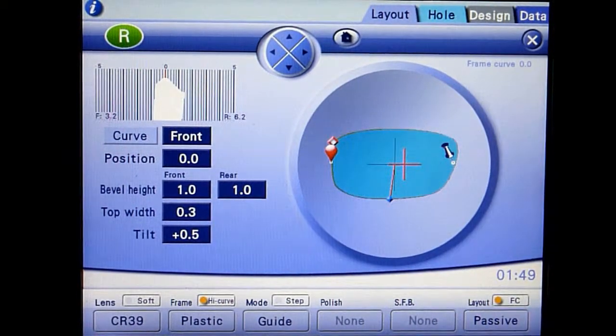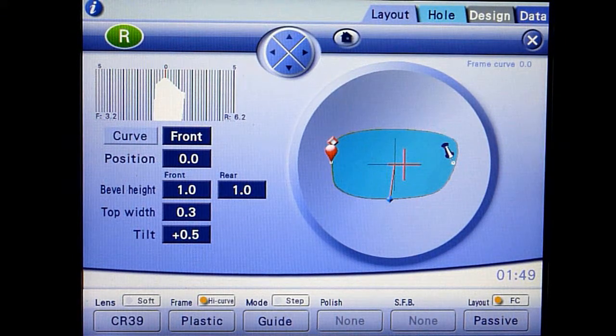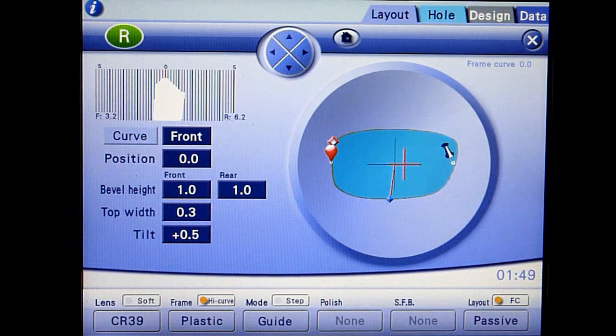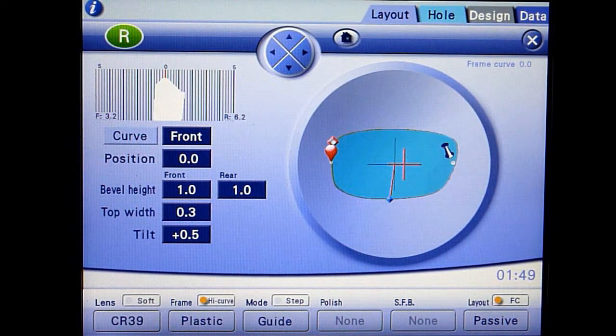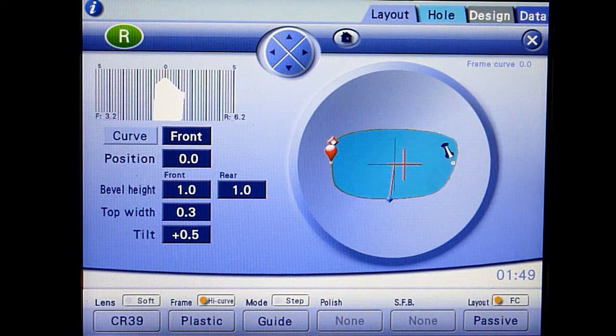After the roughing cycle, the edger will pause and the bevel simulation screen will appear showing the profile of the lens.